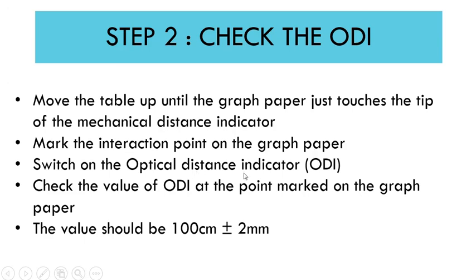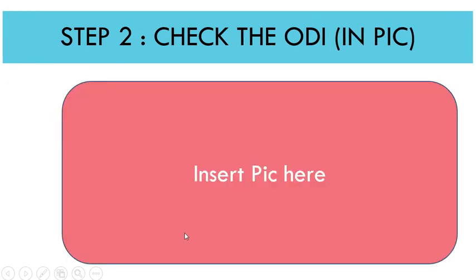Now switch on the optical distance indicator and check the ODI value at the point marked on the graph paper. The value should be 100 centimeters plus or minus 2 millimeters — this tolerance comes from TG-142. This is the check at the isocentric value.